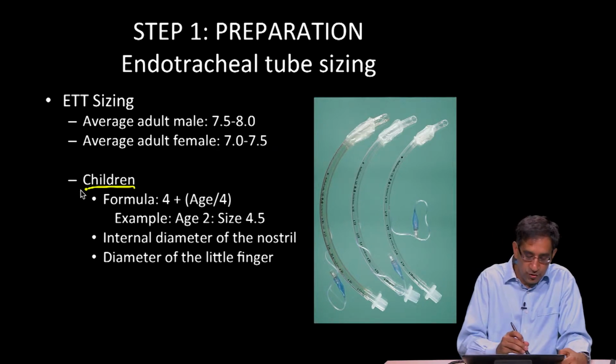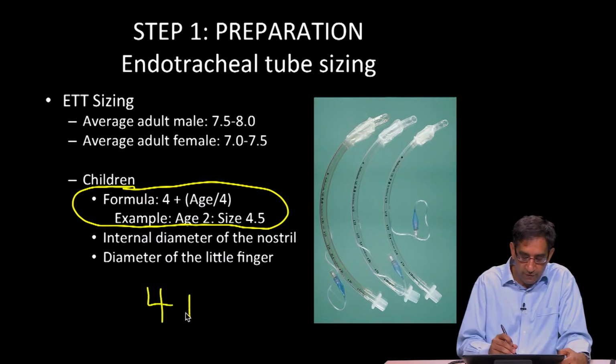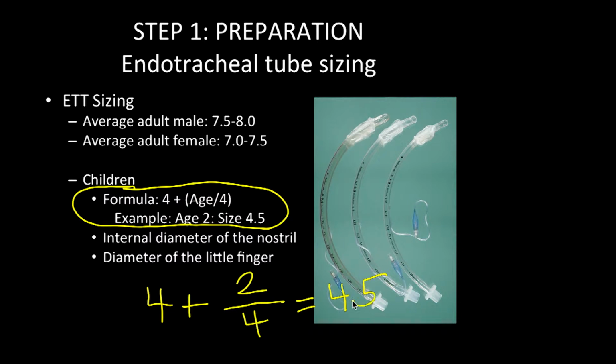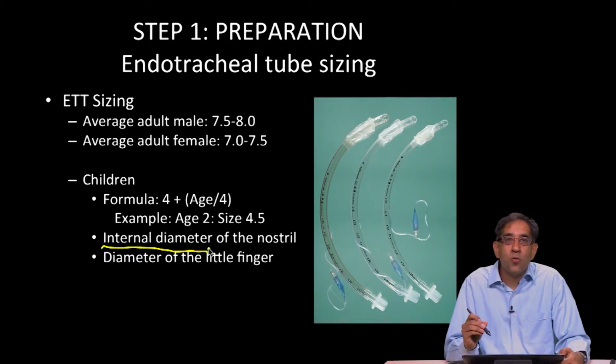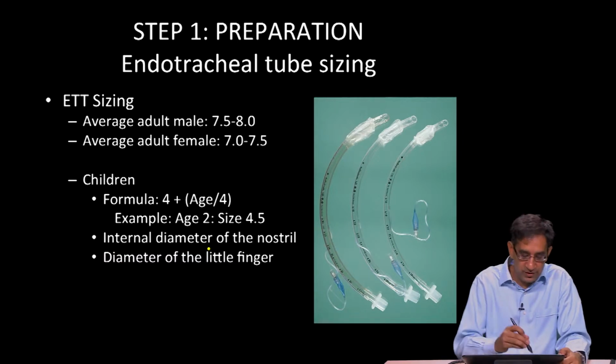And so we have a very useful formula for determining what size endotracheal tube you'd have ready for a child, and it is 4 plus the age divided by 4. So for example, in a 2-year-old child, the formula would be 4 plus the child's age 2 over the number 4, and that would equal 4.5. So for a 2-year-old child, we want to have a 4.5 size endotracheal tube available and ready. The other ways of estimating the size of an endotracheal tube in a child are to try and find a tube that fits within the internal diameter of the nostril, and also one that matches the diameter of the patient's little finger. However, in general, I like to use this formula.